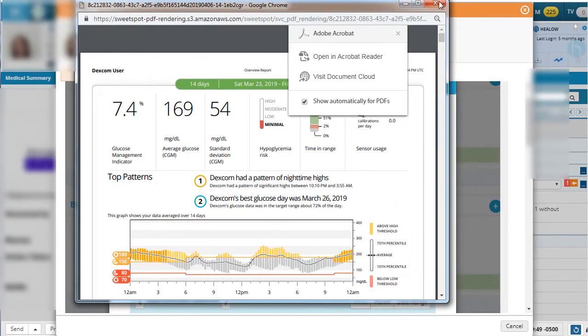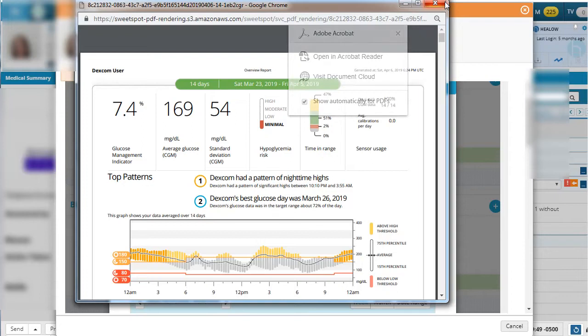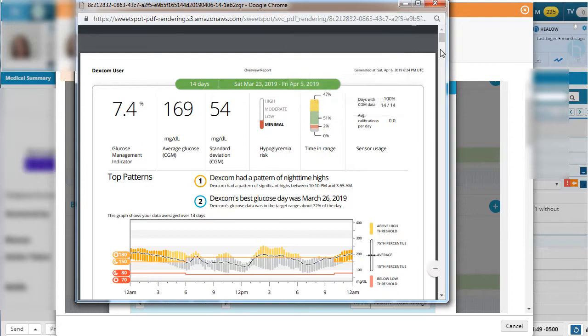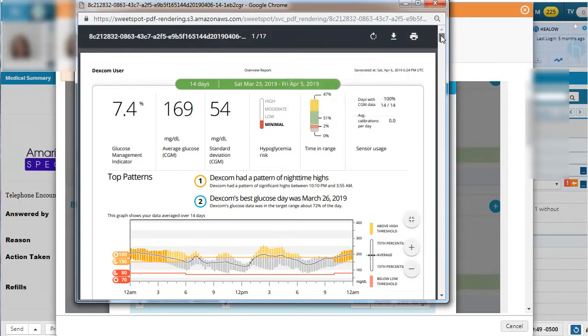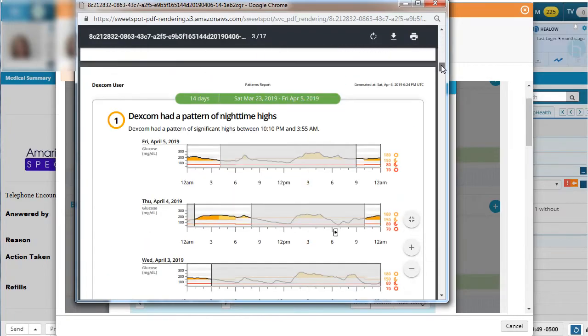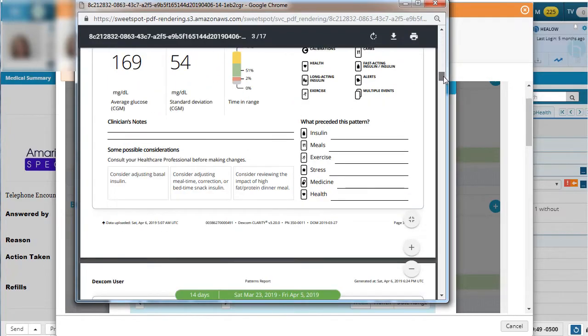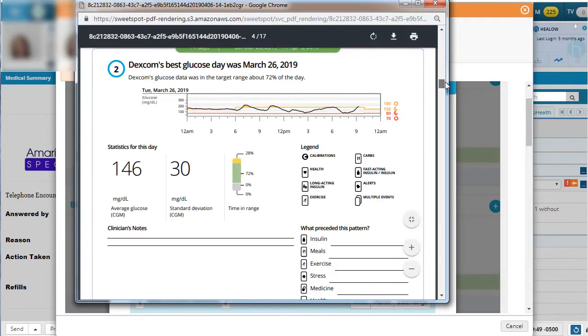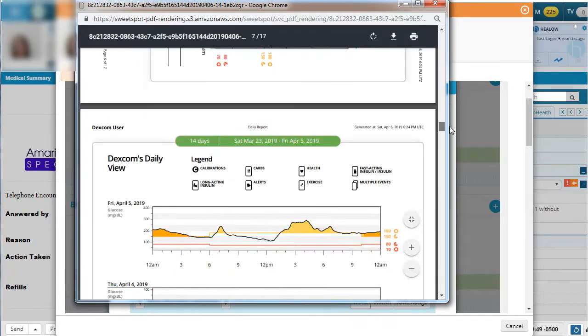The reports are identical between the two versions. You can again see the glucose management indicator, average glucose, time and range, and the percentage of time that the device was active.